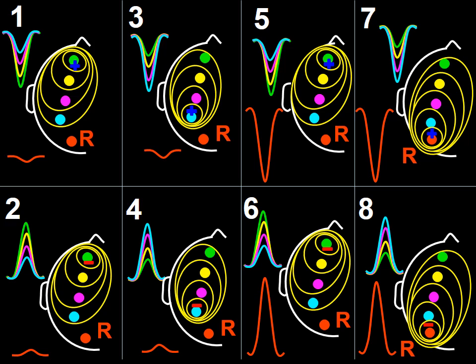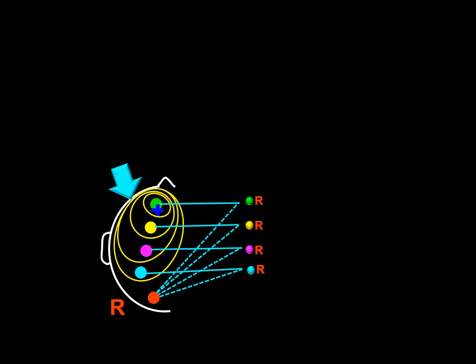These possibilities can be considered by asking ourselves specific questions. Regarding the first possibility, we can ask ourselves, are we dealing with a frontopolar positive field and a minimal positive reference? Here, I am representing a positive frontopolar field being monitored by a common electrode reference montage with the reference located at the minimal positivity.